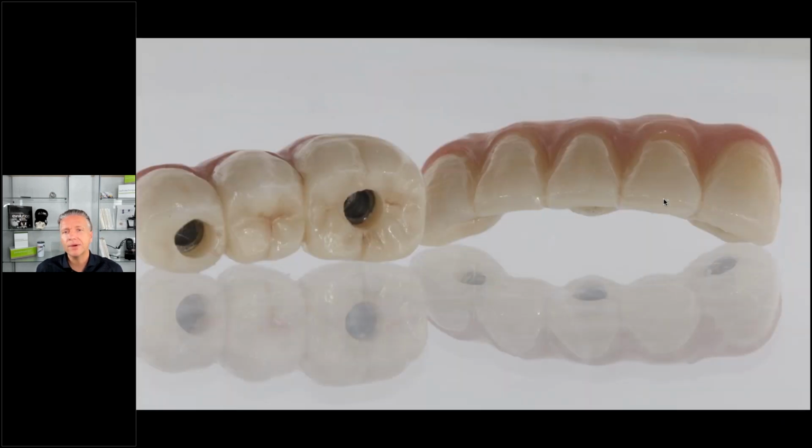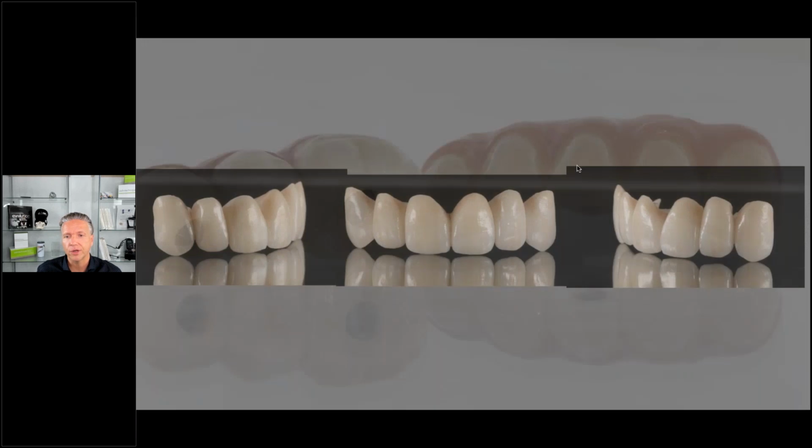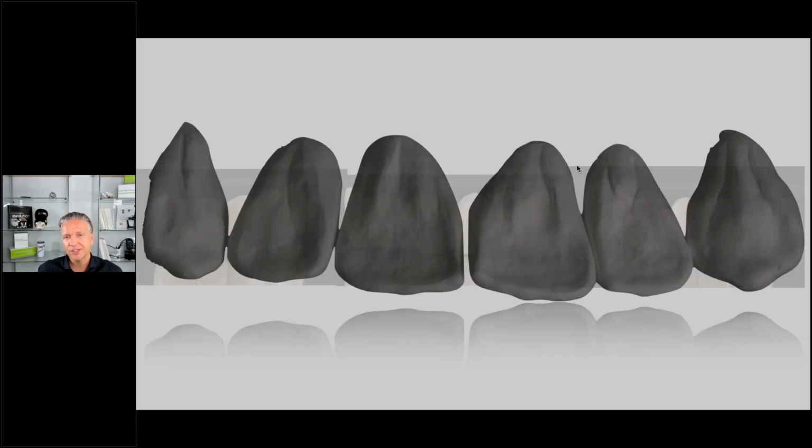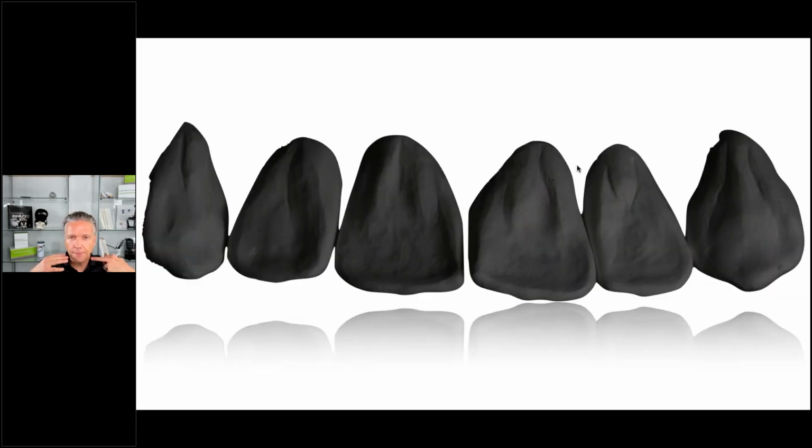So here just zirconia restorations, I just want to show light reflections, texturations basically, how we can make things natural. For me, the biggest challenge is definitely lower anteriors, to have that nice tapered look with the line angles. That's challenging to do, to make it natural, to really look good. Here, anterior crowns, just to show different shapes and different texturations. That's a zirconia. I just want to show the linguals also have texture and anatomy. It's very important. We cannot forget about the linguals.